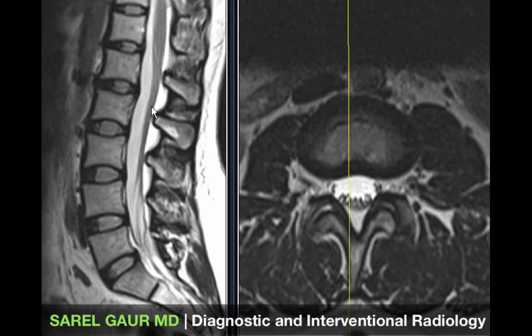Inferior to this level is the cauda equina, which is just the individual nerve roots running through the CSF. I can see the CSF surrounding these structures, and this is all enclosed in a dural sac.